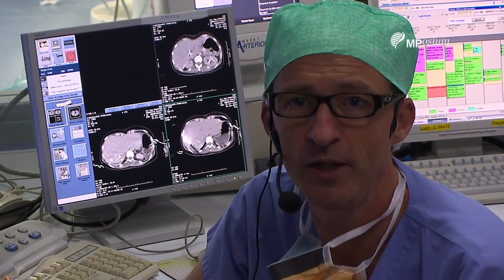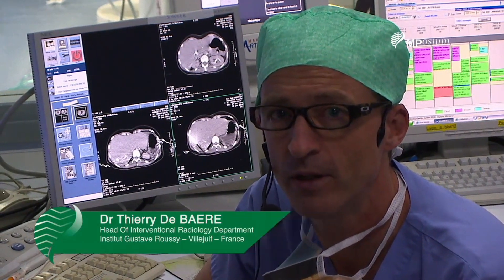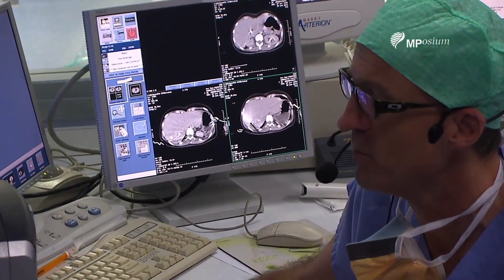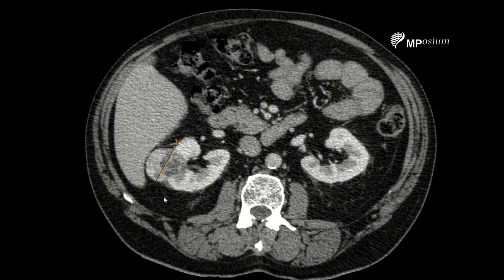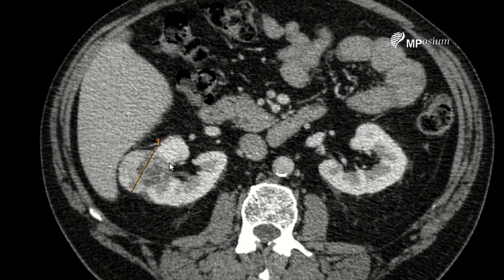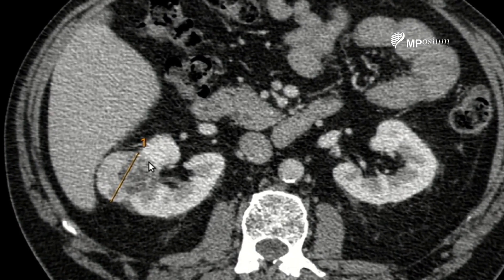During the next case we'll deal with a 61-year-old male patient that came to my consultation after a biopsy-proven renal cancer was discovered. We can see that we deal with a slightly over four centimeter cancer and we'll try to do a complete ablation of this tumor. We'll use cryo ablation and we're very careful about getting a safety margin in the internal part of the tumor, which obviously is more difficult to achieve.